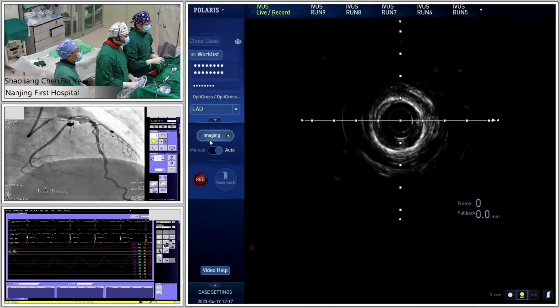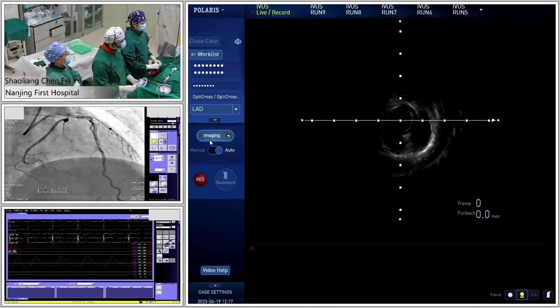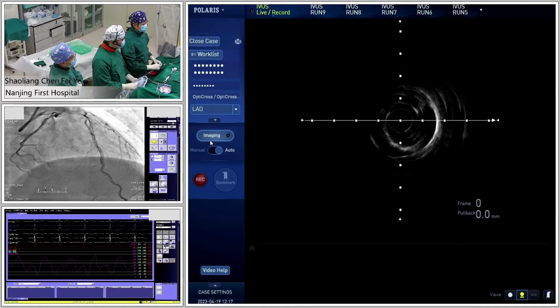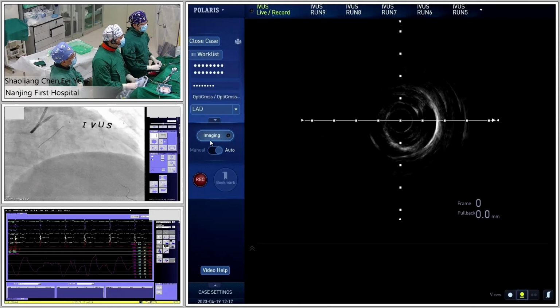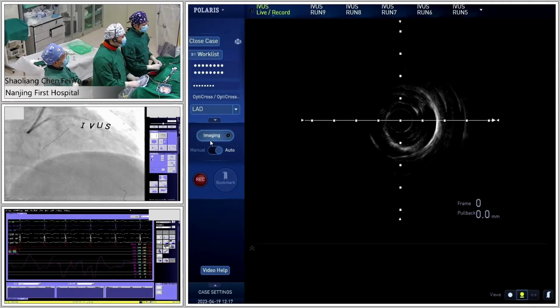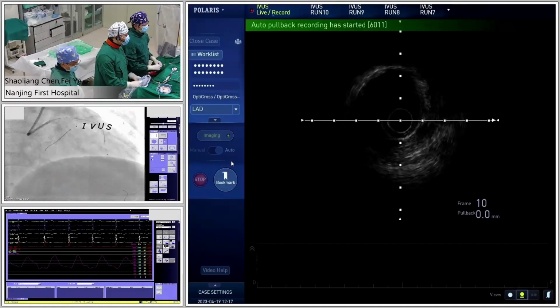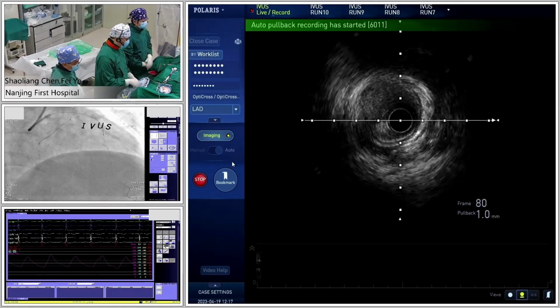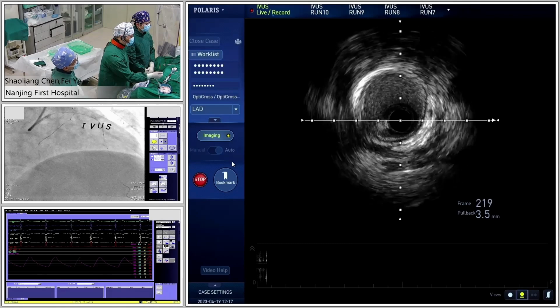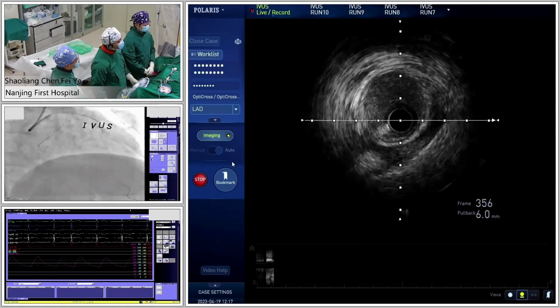The final decision is based on the IVUS finding. We will make sure the correct size of the stent is put in the LAD and crossover. So finally, the final key point is that POT balloon is very important for this case, just because there is a mismatch. And the stent in the left main should be POT before rewiring to the side branch. That's all. Thank you.